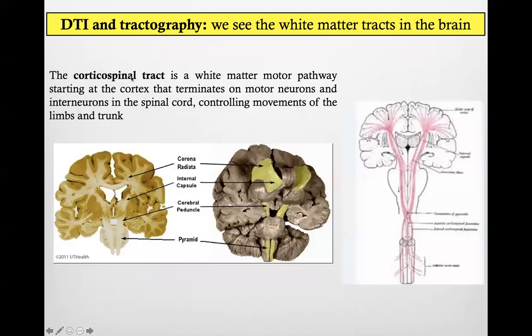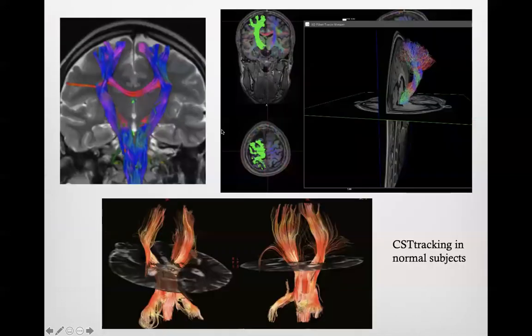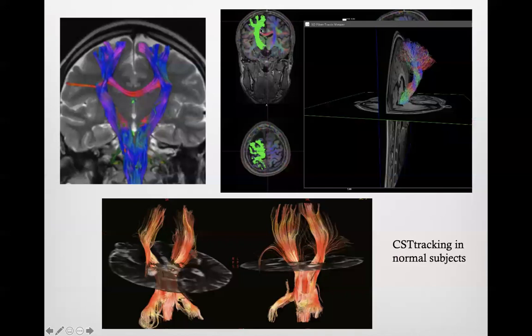We can use the same approach with the corticospinal tract, which is the part of the brain that controls movement and goes from the rolandic cortex down to the spine and nerves. Look how similar the reconstructed corticospinal tract on both sides is to the anatomical view. And this is just a different graphic way to show the corticospinal tract.